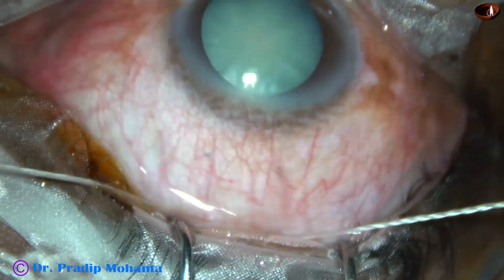Before I oppose the conjunctiva, I am going to remove the viscoelastic very nicely. This is irrigation of the anterior chamber as well as the capsular bag. Now irrigation and aspiration through the side port. I am going to use bimanual irrigation-aspiration to remove viscoelastic thoroughly, because I already have two side ports. Irrigation and aspiration together — the visco is nicely cleaned.